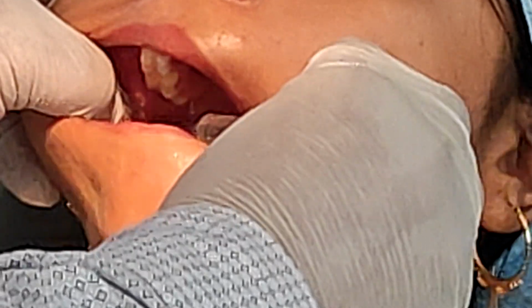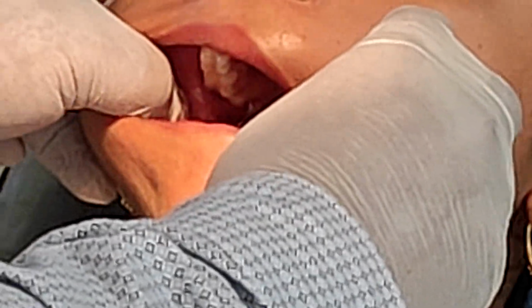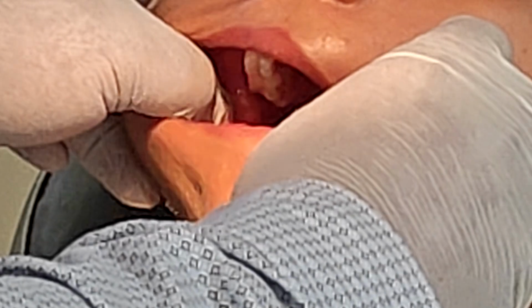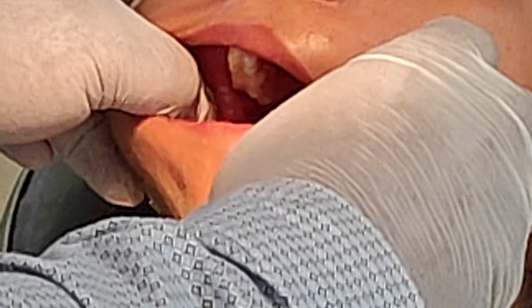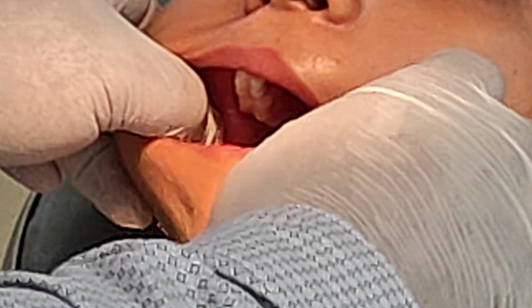Once you insert it, stabilize the syringe, aspirate. On negative aspiration, start injecting the solution. Approximately 1.5 to 1.8 ml of solution over 30 to 60 seconds has to be given.